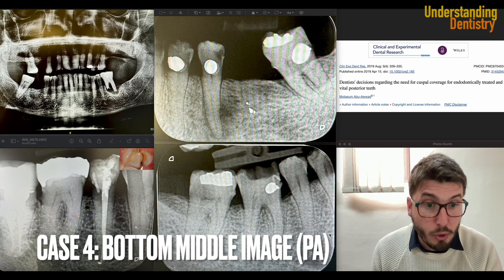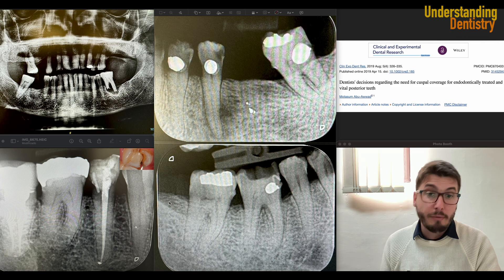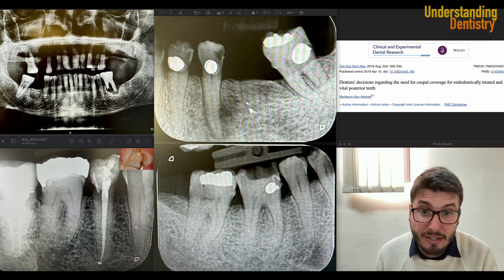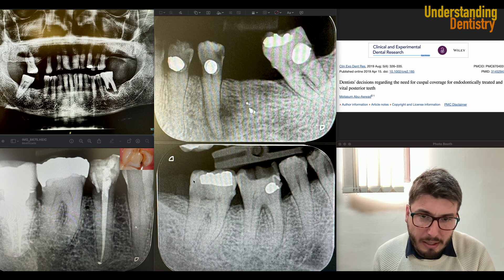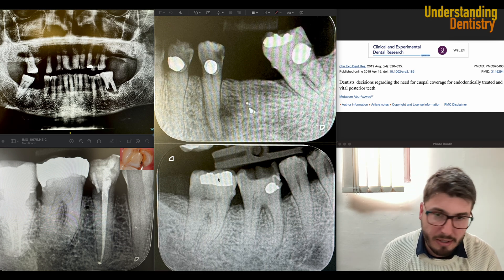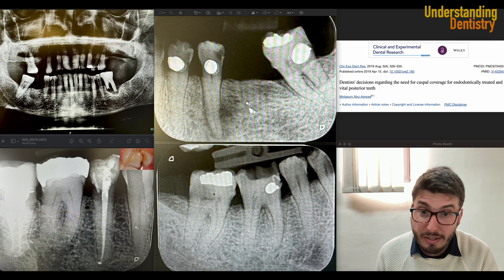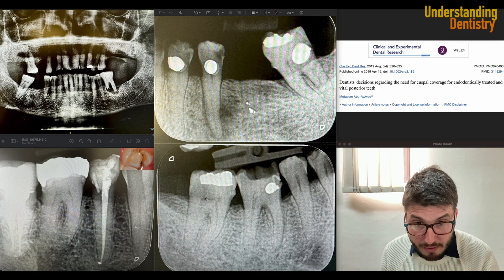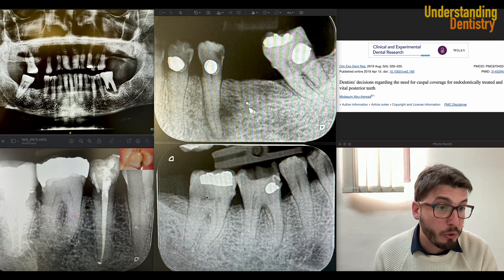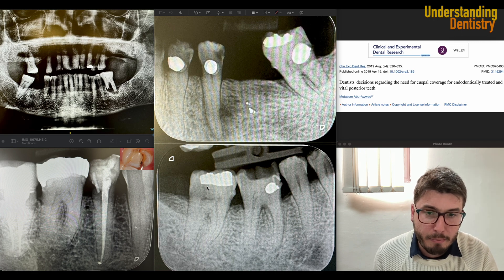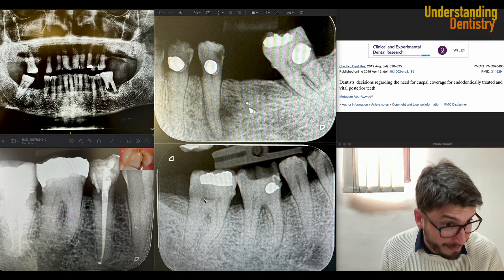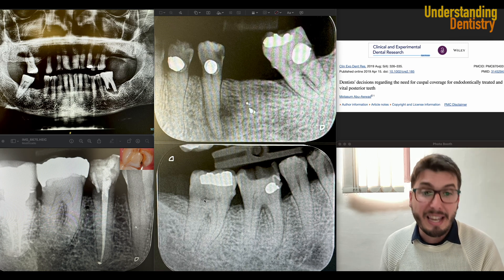Going to the lower radiograph at the center of your screen — the patient had pain in the lower right quadrant. There is a metallic restoration with a radiolucency at the crown. You can see the contour of the enamel is still okay, but you are suspecting recurrent decay. The pulp chamber is atrophic, there is a little periodontal ligament space widening, and since the patient is in pain and the radiolucency of the caries is now in continuation with the radiolucent space of the pulp chamber, root canal treatment is indicated.